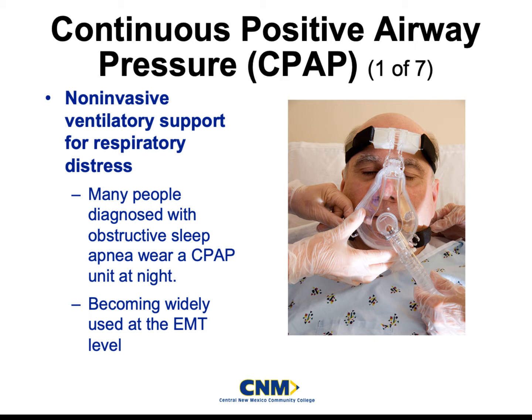However, this is definitely a procedure that you are going to have to explain to your patient and really make sure that you get the trust of your patient. Once again, we have a patient that is short of breath. They might be a little anxious.